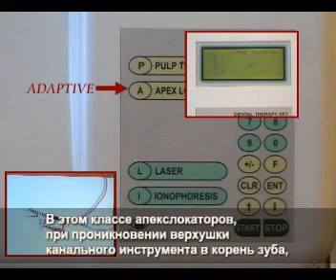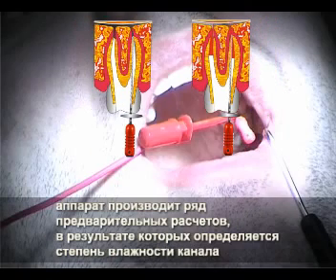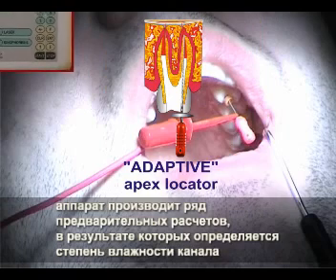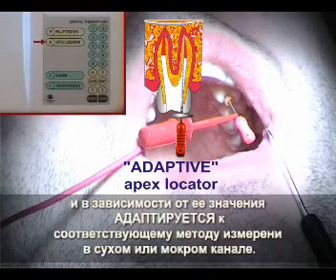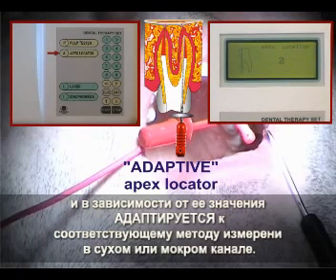For this type of apex locator, on inserting the tip of the file in a root canal, the device makes a set of preliminary calculations to determine the degree of humidity and, depending on it, adapts the method of measurement for a dry or wet canal.